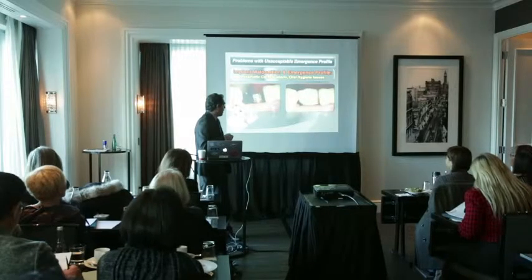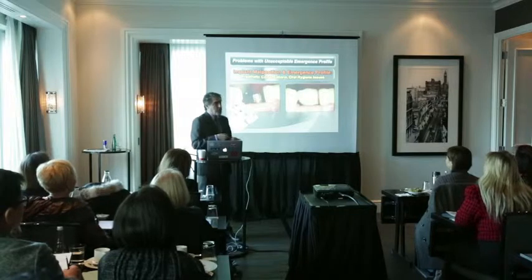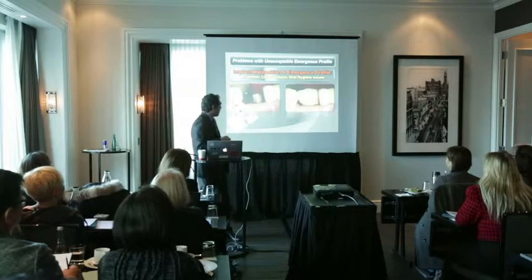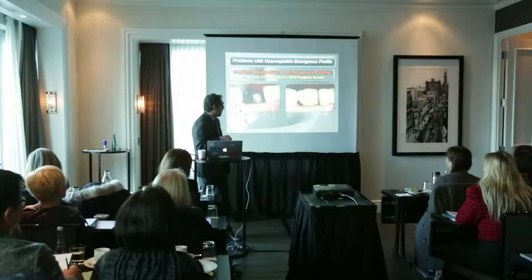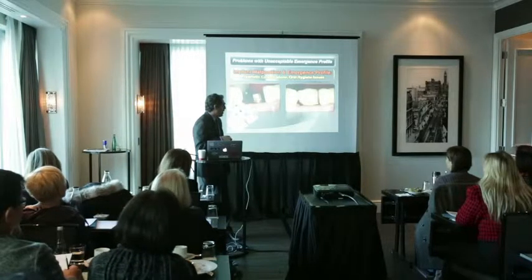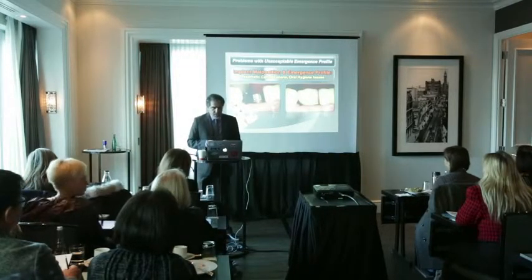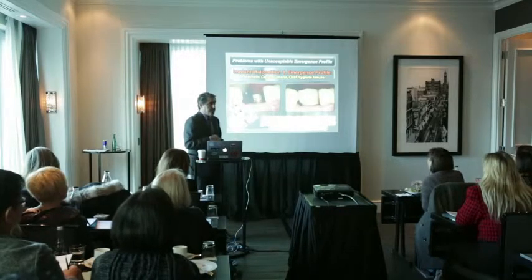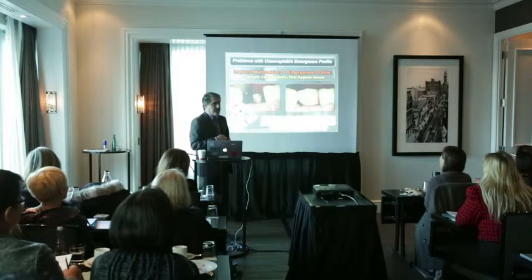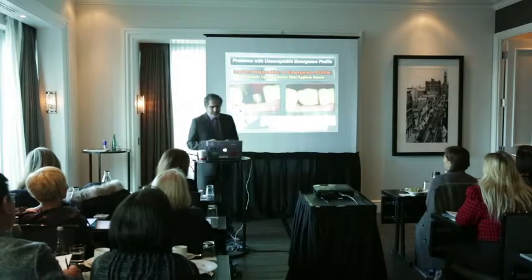From here, you're going to have a difficult time forming the emergence profile, almost no proper emergence profile. At the same time, you're going to have quite a bit of room here and also under this pontic-like part of the crown. You will be praying that this implant will fail. That would definitely be a better option than having this one in this place.